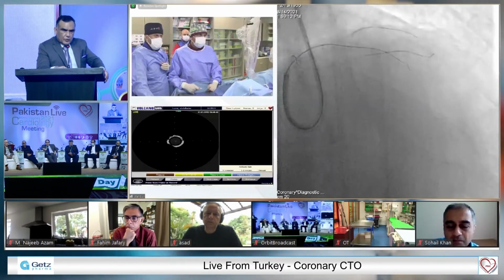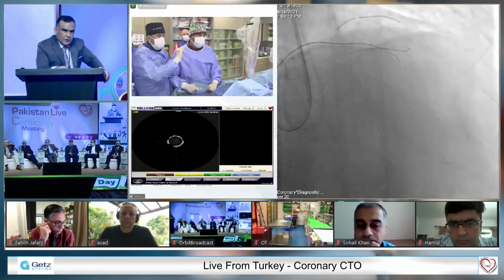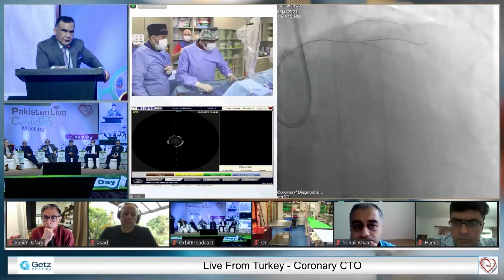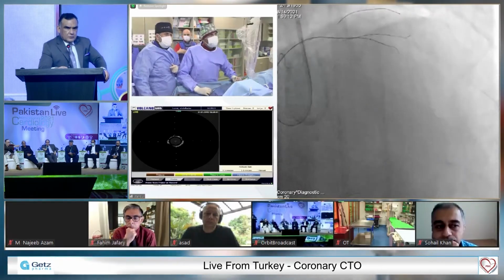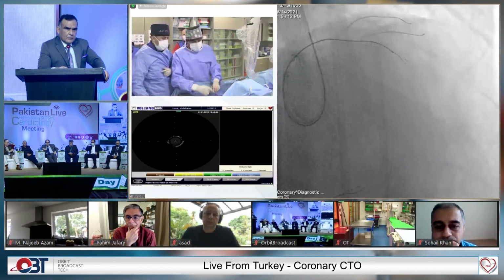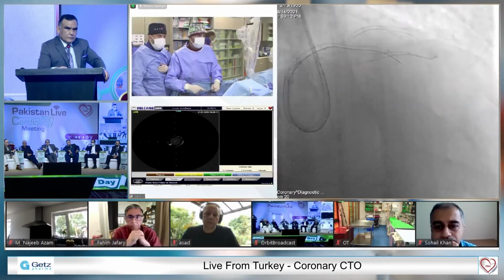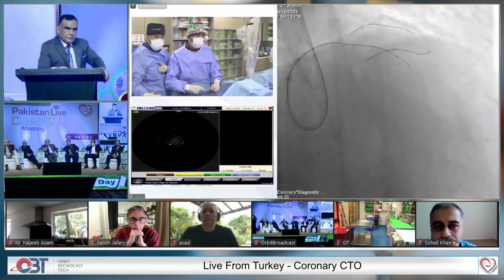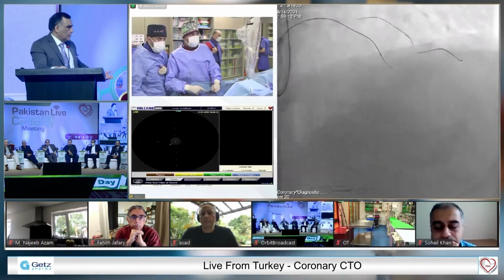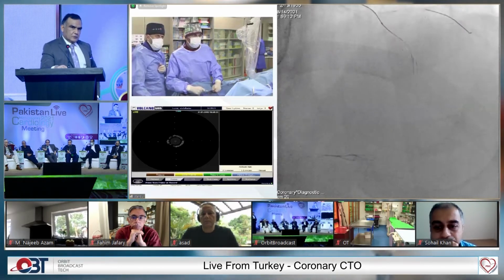Umar, what's the downside of checking with an IVUS, removing your microcatheter and then using IVUS as Suhail suggested? I don't think I could easily, Nadim. It would be difficult to cross it actually. Not easy to insert IVUS. I don't know.